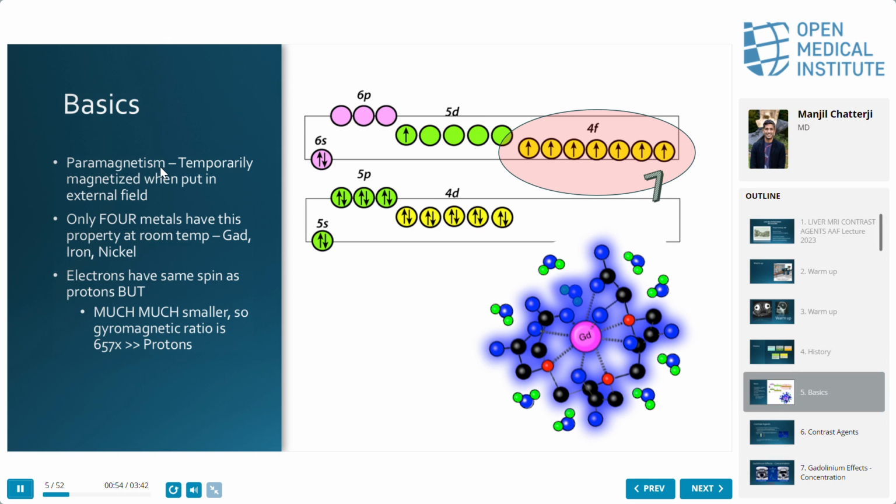Fat, water, soft tissue are all within milliseconds of each other in terms of their precession. And what that means is MRI is looking to exploit these tiny differences between protons, between, let's say, gray matter and white matter, or water and fat. Though in reality, these substances are all very, very hydrogen rich and very biologically similar, okay?